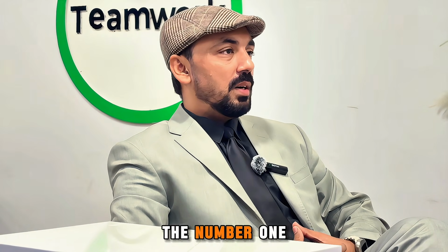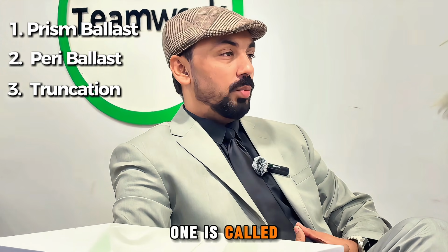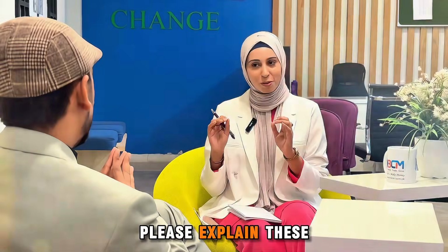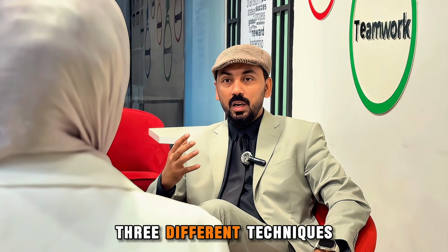So the techniques are, number one, the prism ballast technique, right? Then the second is the peri-ballast, and the third one is called the truncation. Sorry to intervene, sir, but can you please explain these techniques? Yes, for sure. As we discussed, there are 3 different techniques.